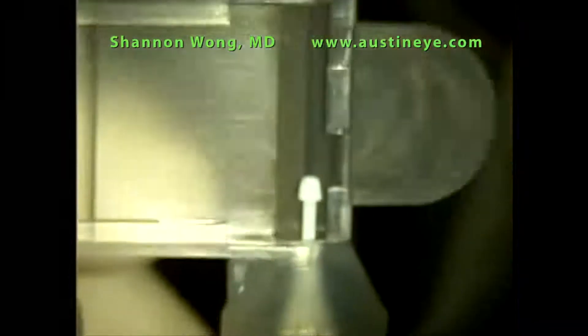This is Dr. Shannon Wong. I'm an ophthalmologist at Austin Eye. I'm going to describe how we insert a CrystalLens AO using the CrystalCert insertion system.